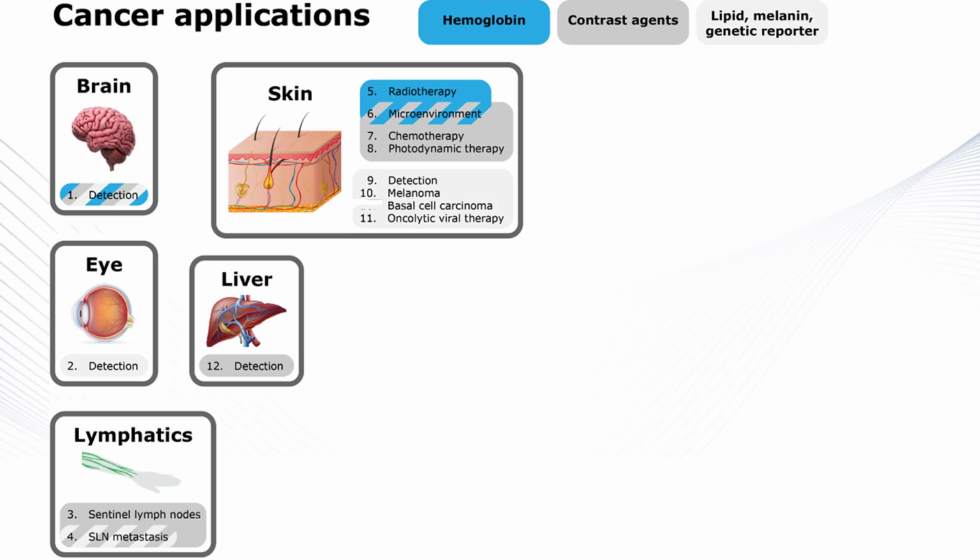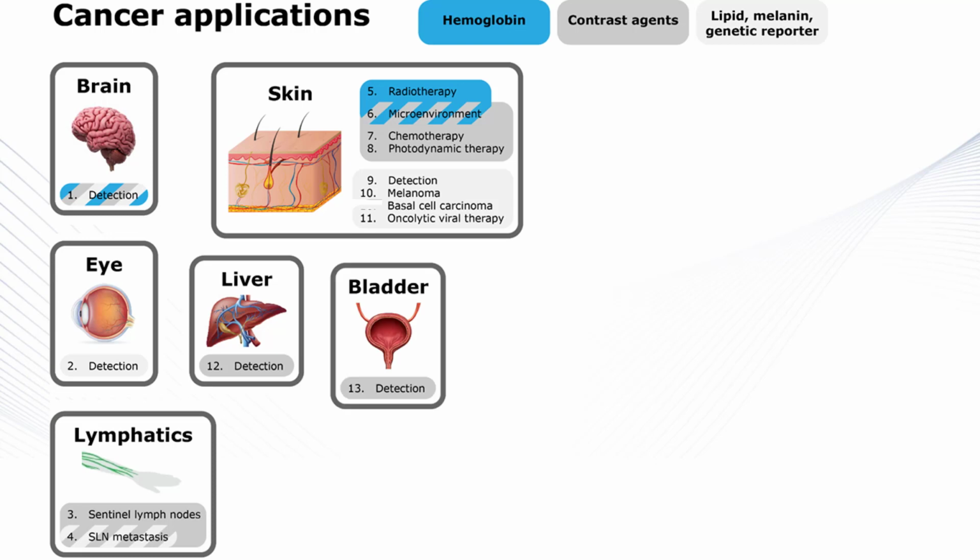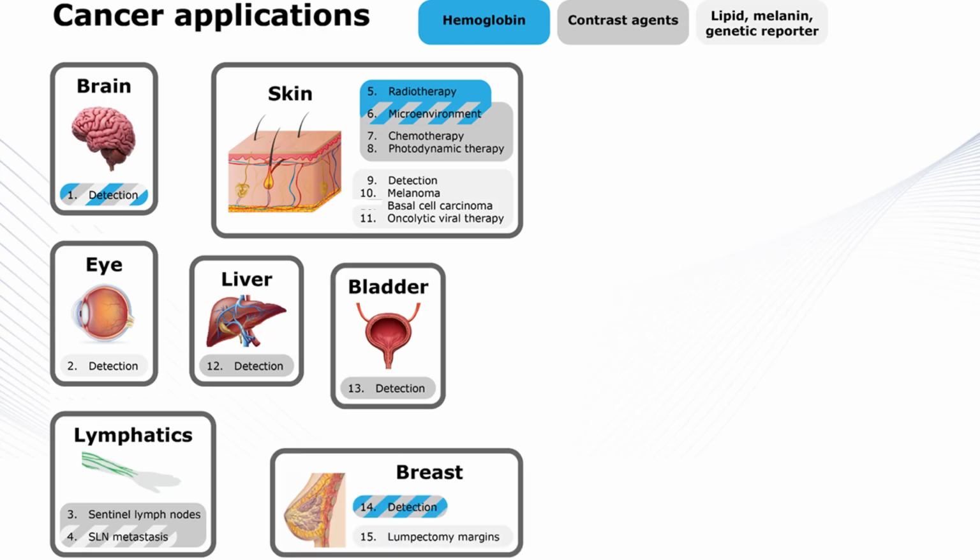In terms of the liver, preclinical models have shown detection of lesions in the liver. The same is true with bladder in preclinical models. And both on the preclinical and clinical side, breast lesions have been detected in living subjects. The largest clinical study ever done was actually done in 2,000 patients using optoacoustics, not our platform, but another. But the point is that this technology is now being used, let's say, with large clinical trials. So I think that's a very exciting advance for the field of optoacoustics.